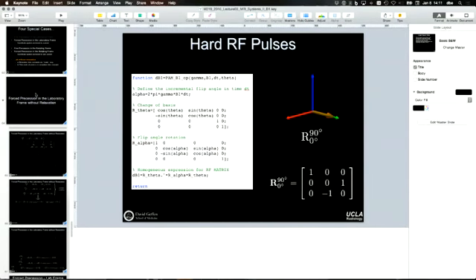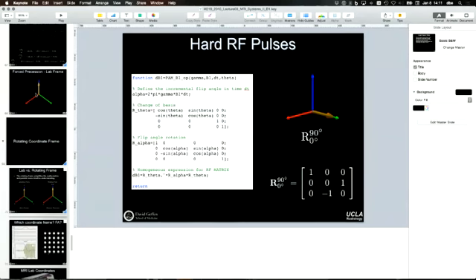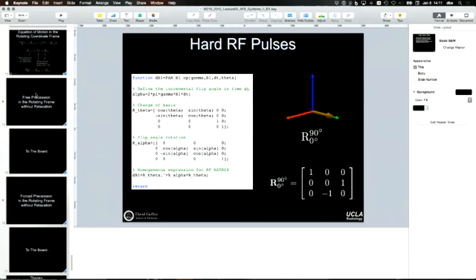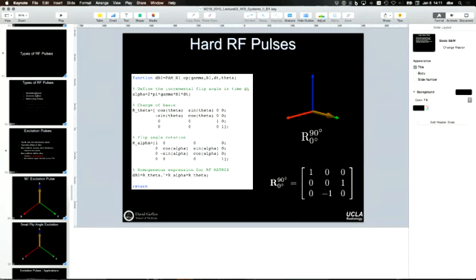And so it's set up so that once this falls down there, you'll notice at this instantaneous point in time, this has the same direction as the B field, so there's no doubt on that. That's all to do with the phasing, to make sure that once your bulk magnetization gets knocked into the transverse plane, it's not getting bounced around by whatever magnetic field you have.